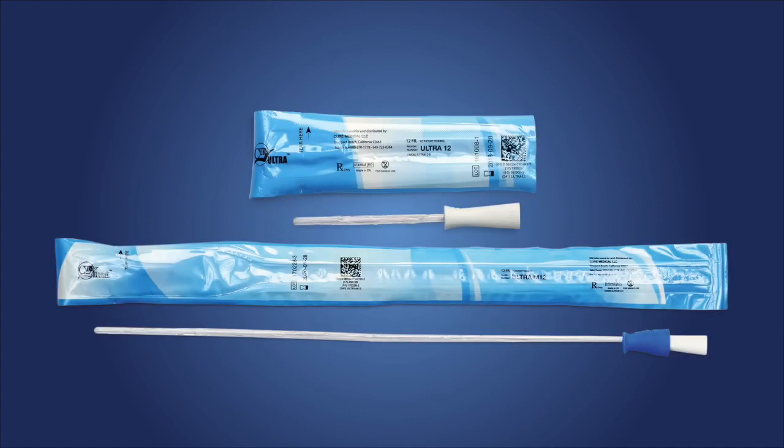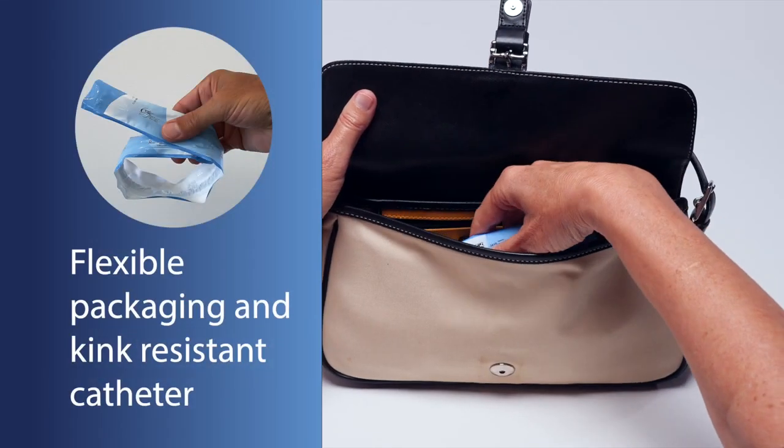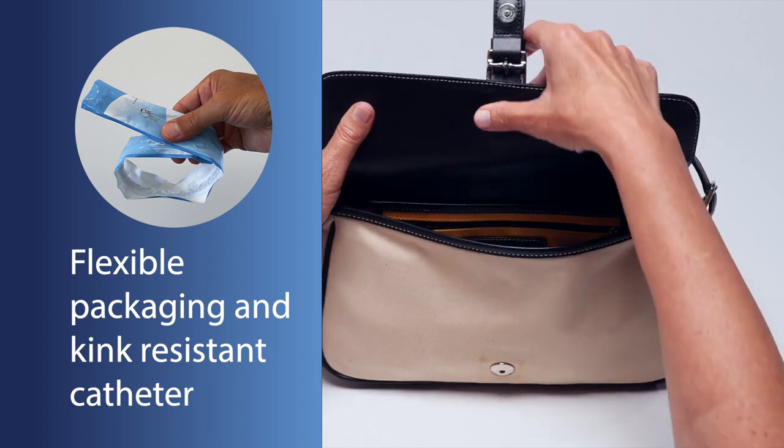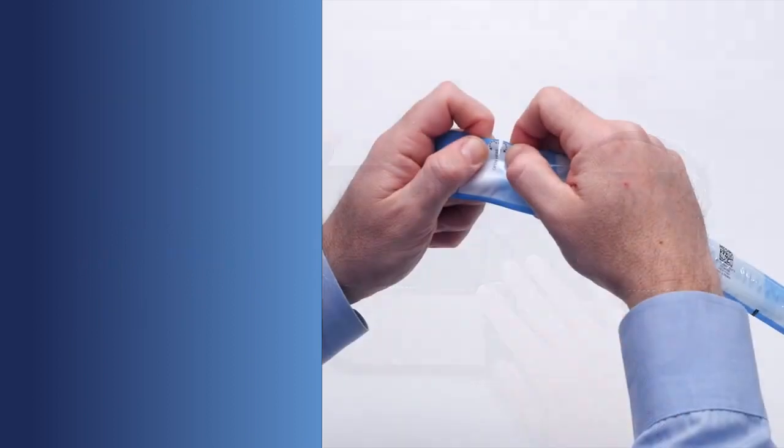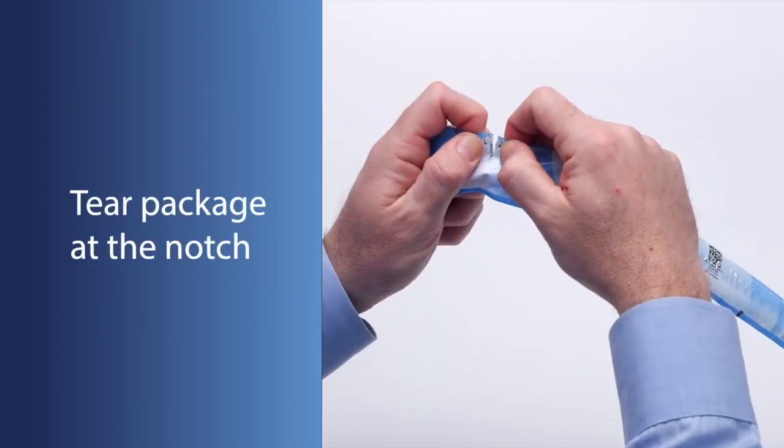The Cure Ultra is offered with a straight tip for women. Tip options for men include coude and straight tip. The small, flexible packaging and kink-resistant catheter make the Cure Ultra conveniently portable. With clean hands, tear an opening in the Cure Ultra package at the notch.